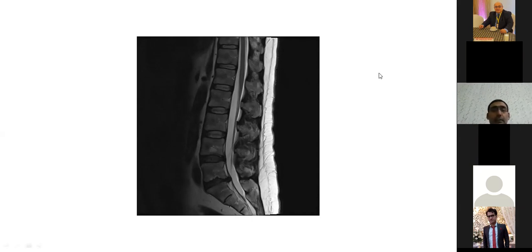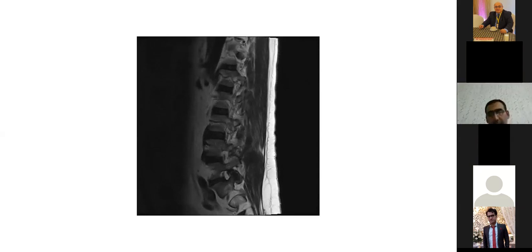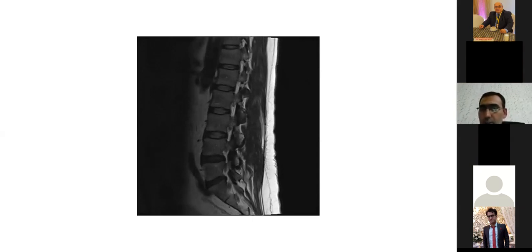Looking at the discs on T2: a bright signal in the disc indicates a normal hydrated disc because there is fluid in it. At the bottom of the disc, you can see less high signal, indicating dehydration, and the disc itself may be bulging into the canal. You can scroll through sagittal images to see different anatomical parts.